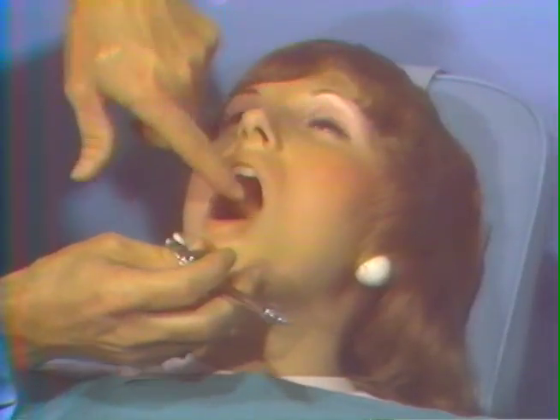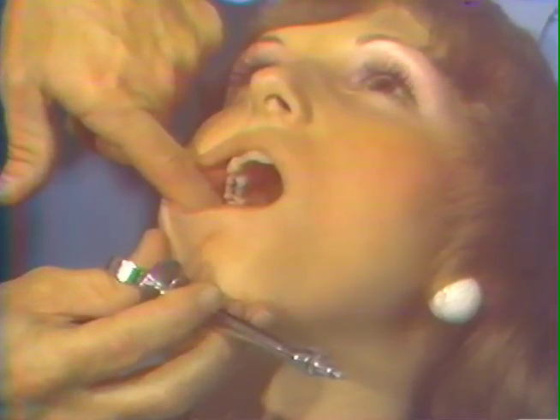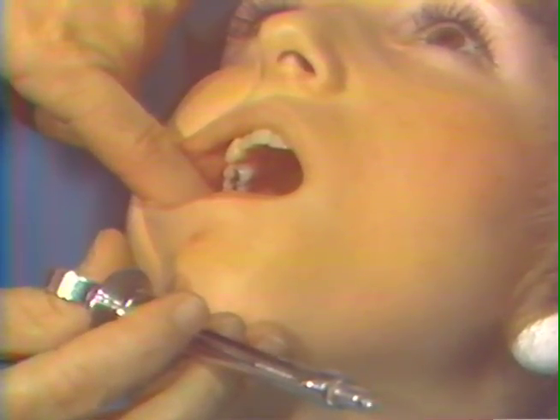Open real wide, relax your cheek, don't let me turn your head. The greater palatine foramen is located in the vicinity of the second molar tooth, approximately 1/3 to 1/2 the distance from the gingival margin to the midline of the maxilla. Now open real wide. The approach is made in this manner with the mouth very wide, proceeding to the area of the greater palatine foramen, resting on the lower lip and retracting the lower lip.